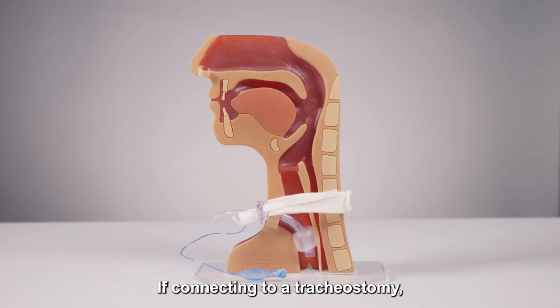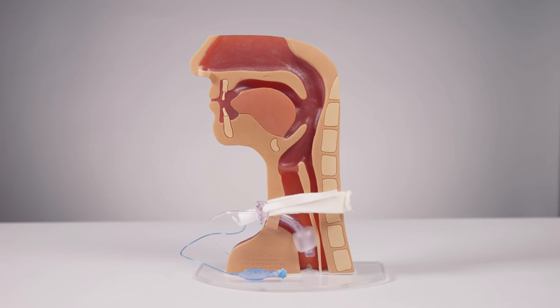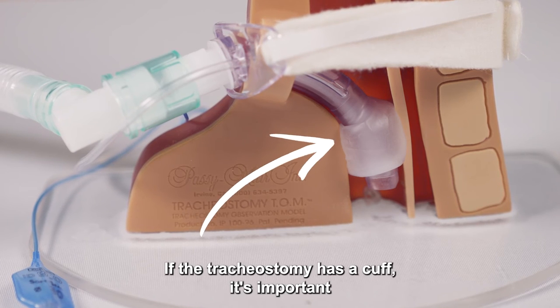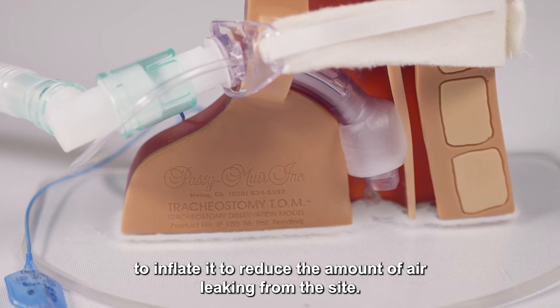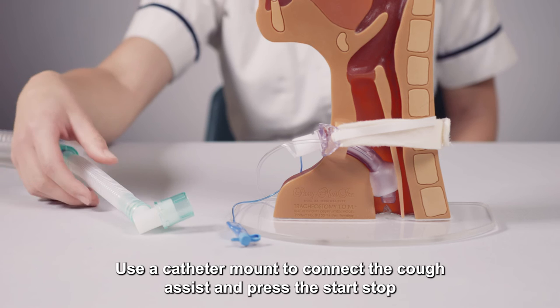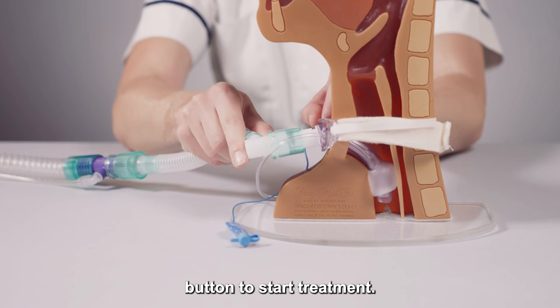If connecting to a tracheostomy, use a catheter mount or tracheostomy connector. If the tracheostomy has a cuff, it's important to inflate it to reduce the amount of air leaking from the site. Use a catheter mount to connect the cough assist and press the start/stop button to start treatment.